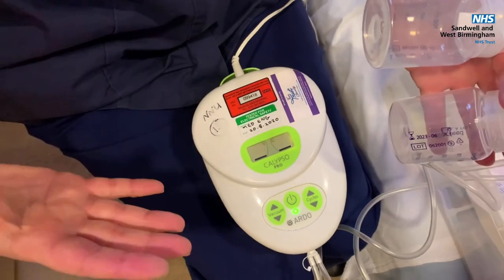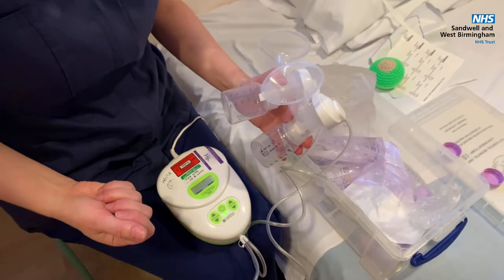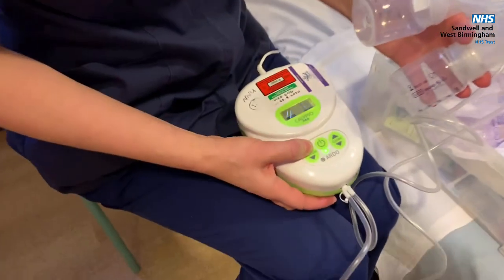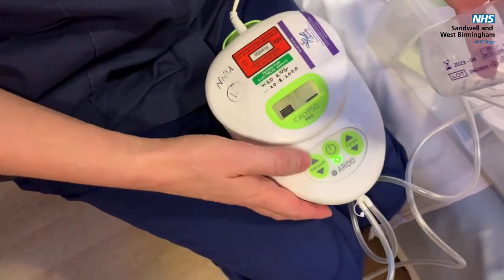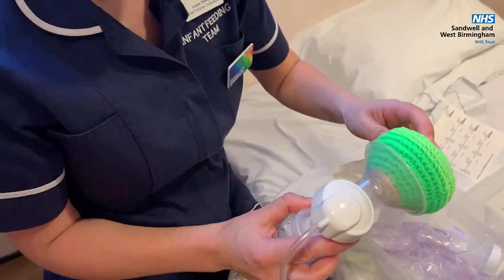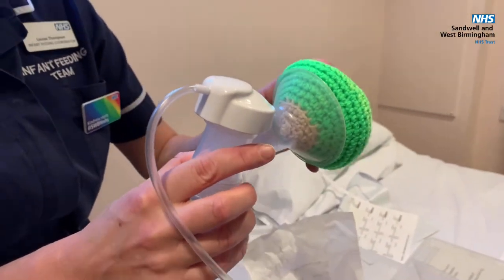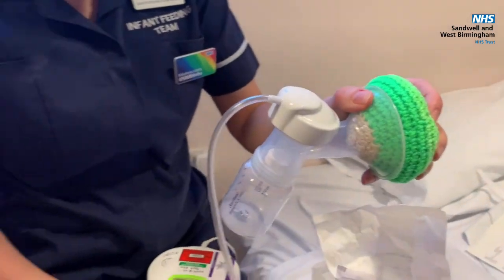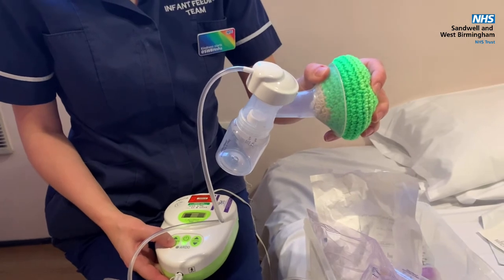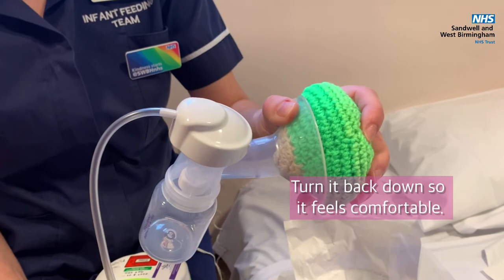Around about day three your milk will come in, and you want to turn the pump on so that it encourages that milk to flow. Turn the vacuum up to where it starts to feel a little bit uncomfortable. Put the pump onto your breasts, centralise the nipple in the middle so it's not rubbing on the side. Pop the pump onto both breasts and turn the vacuum up to where it feels uncomfortable, then turn it back again. You want the maximum amount of suction but you shouldn't be making yourself sore and uncomfortable.